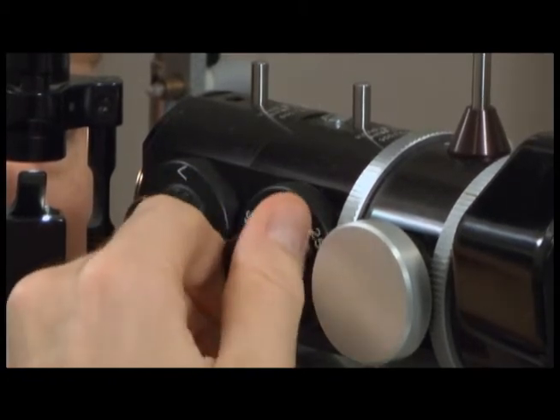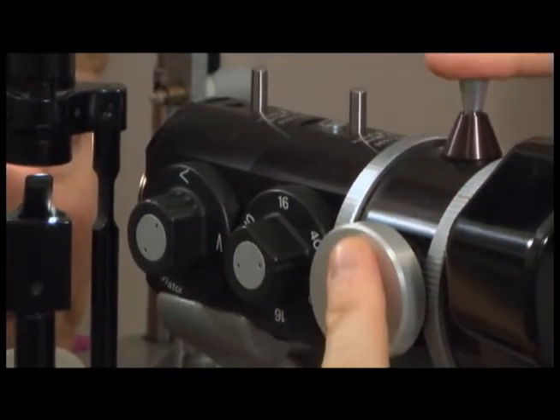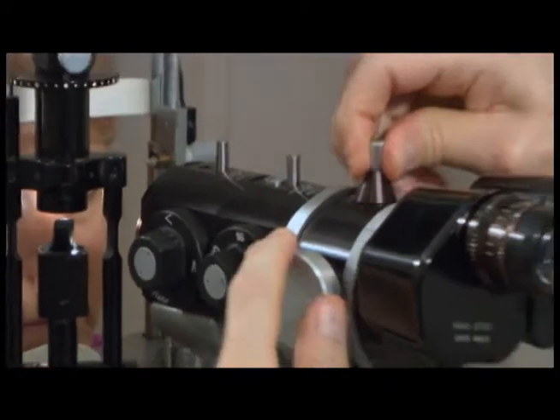There is a space for a teaching scope, which is not on this slit lamp. Pulling on the device superiorly will allow viewing through the teaching scope.